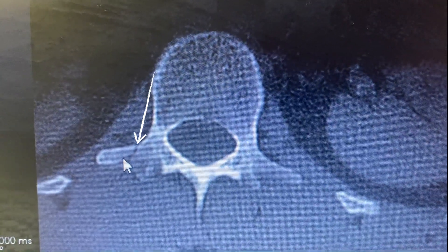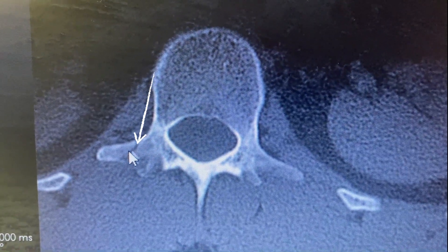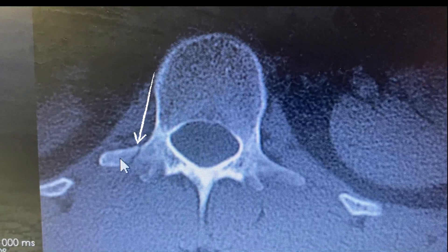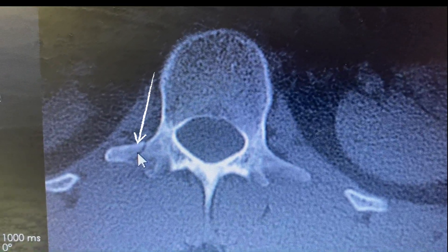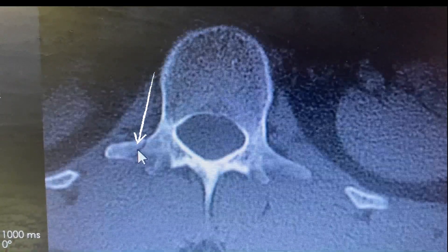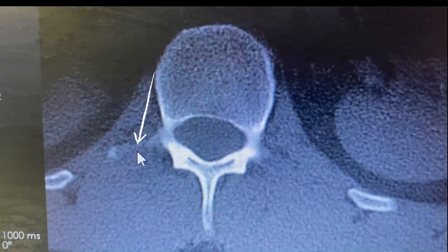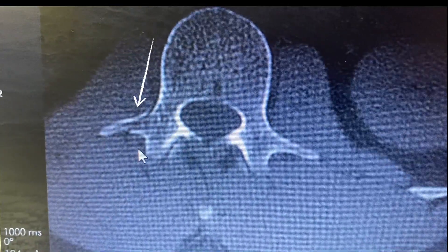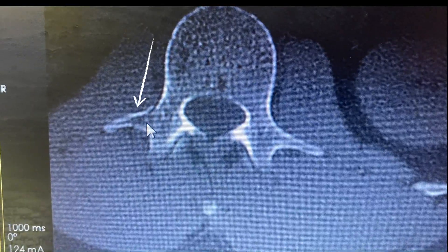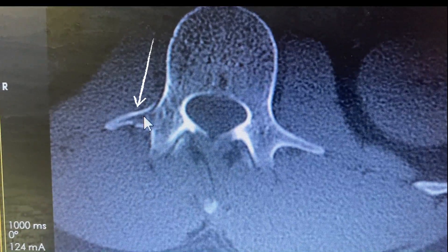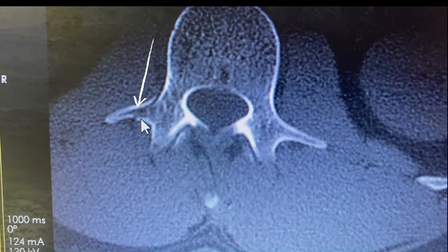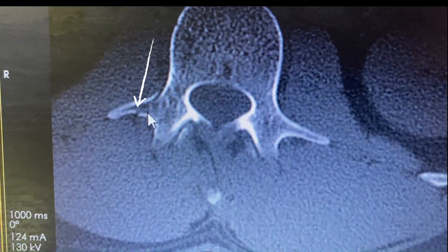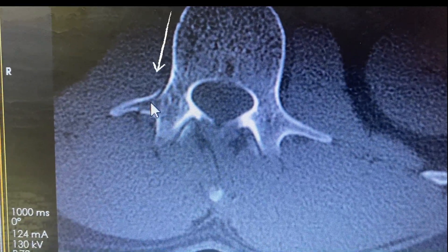There is an evident transverse process fracture of the vertebra. Let's look again — the cursor is now demonstrating the fracture line.